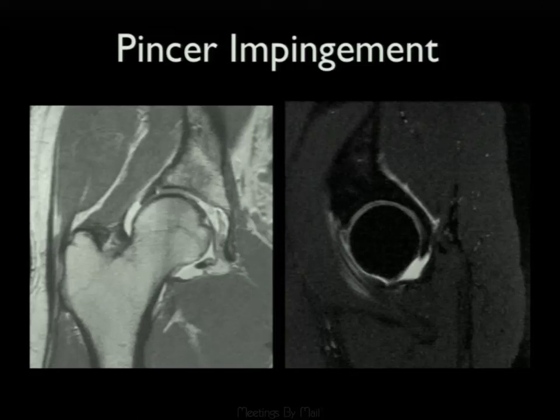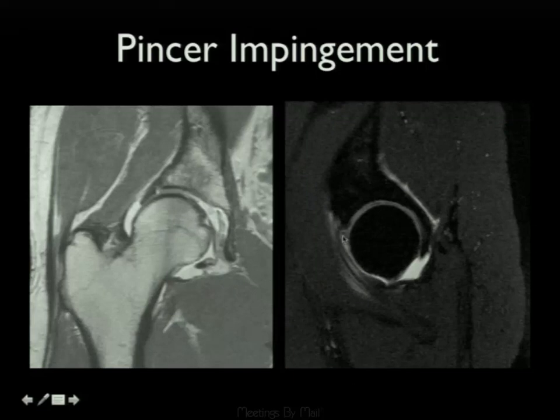In pincer impingement, we also see labral tears and chondrolabral separation. Here is a chondrolabral separation, and on the sagittal MR view, a nice example of an anterior labral tear.